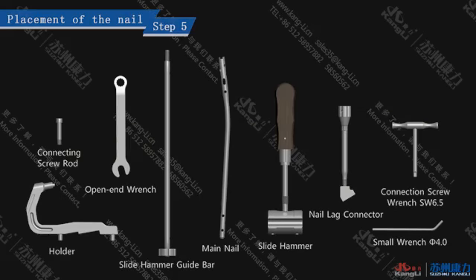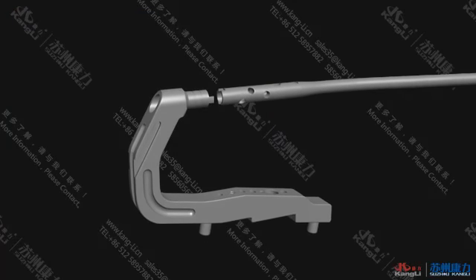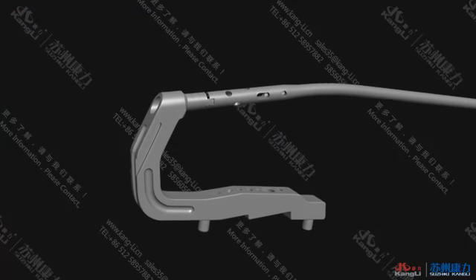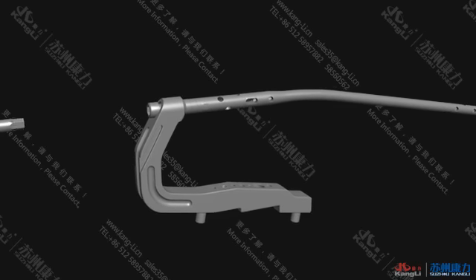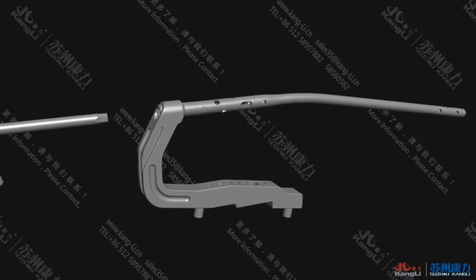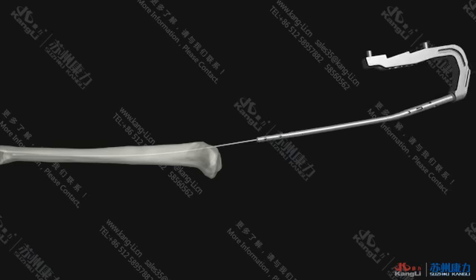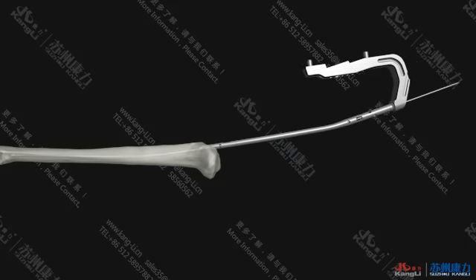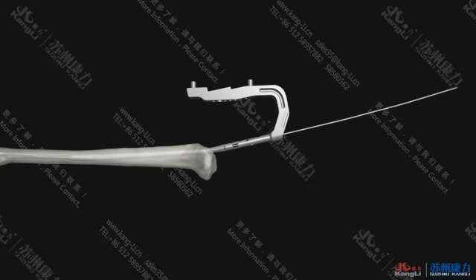Step 5. Placement of the nail. Fix the prepared nail of the KTO intramedullary nailing system onto the holder with the connecting screw rod and tighten it with the connection screw wrench. Insert the ball guide pin and rotate slightly for the entrance of the nail. After the entrance, keep the direction and directly insert it.